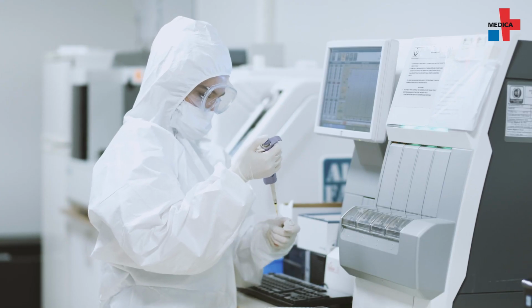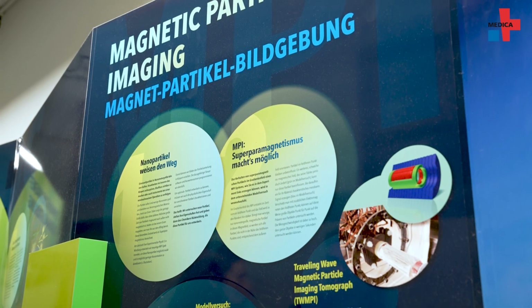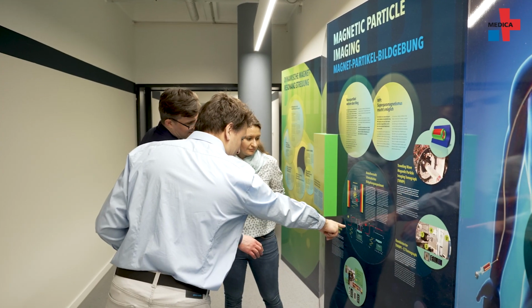To be able to determine the coronavirus using the test method, the physicists needed sufficient samples from patients with different viral loads. The Institute of Virology and Immunobiology was able to support them in this. The physicians there also recognize the advantages over other test methods. The advantage of the COMPASS procedure is, of course, that we can do the confirmation test in one step, so to speak.